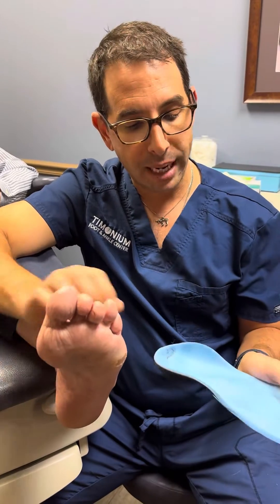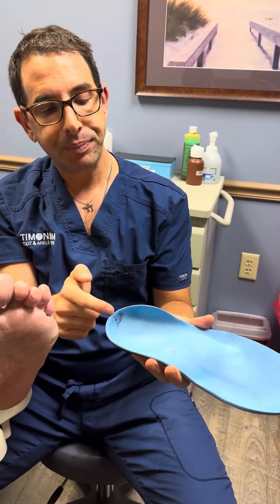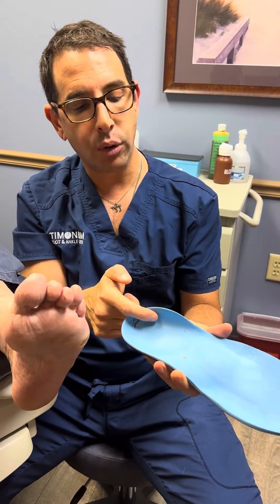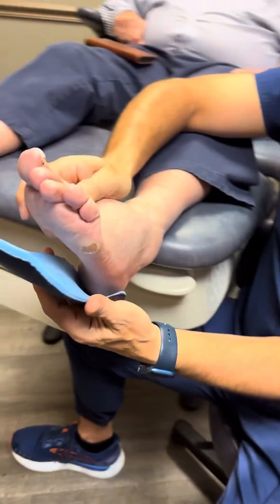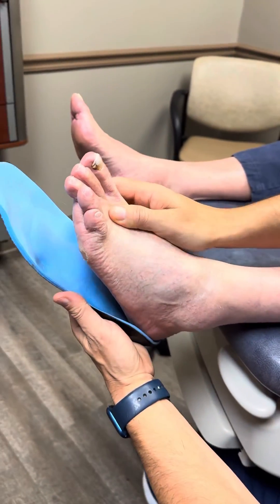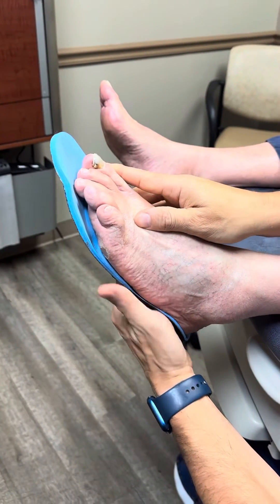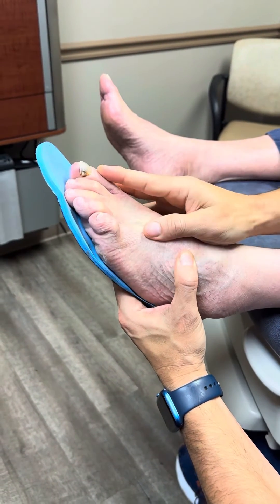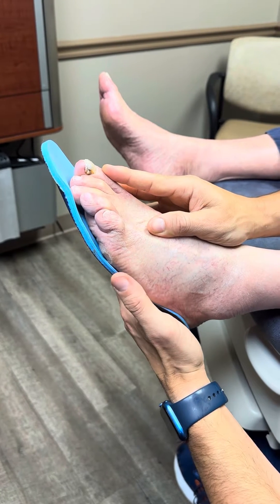What we did was we made a really cool orthotic — an orthotic with a very deep heel cup. And we put something called a lateral flange, which means that it's cupping his heel. Come around here — you can see it's cupping his heel, and we have a cutout right here that's taking the pressure off. You can see how that area is floating in the air.